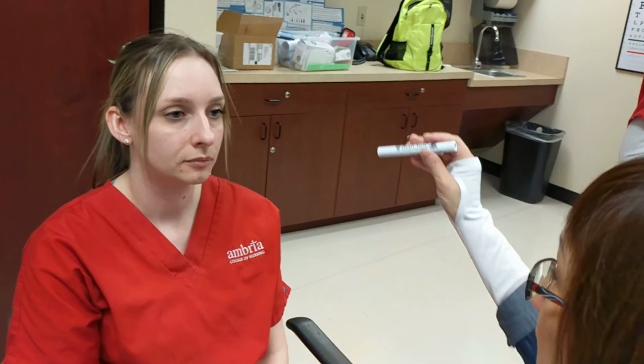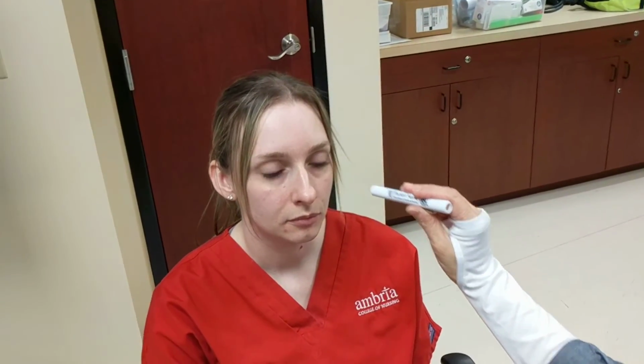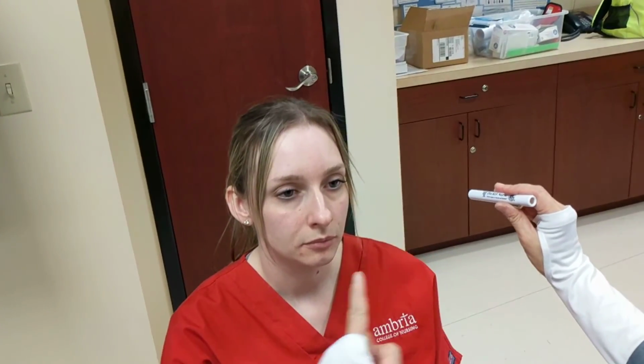So let's do the pupillary reaction to light. I will shine the light on the right eye. Always start from the side. See the pupillary reaction, the constriction. So it's reactive. So that is direct. I shine the light on this eye. Look for the constriction of this pupil. Now I will do indirect. So shine the light here. Look for the constriction on that other pupil. Okay.